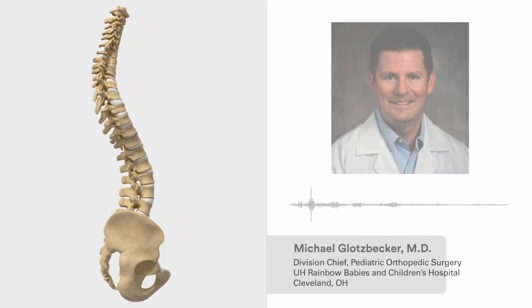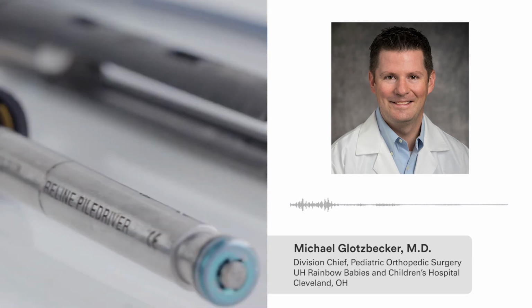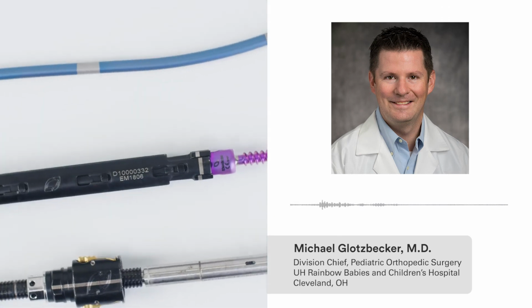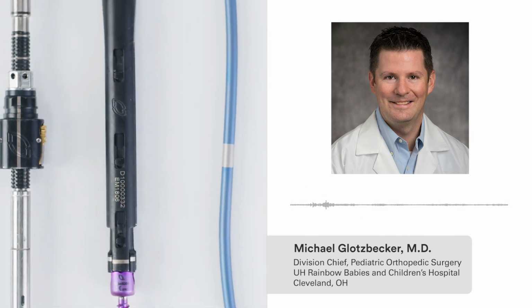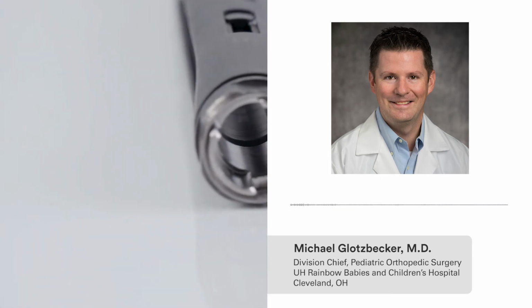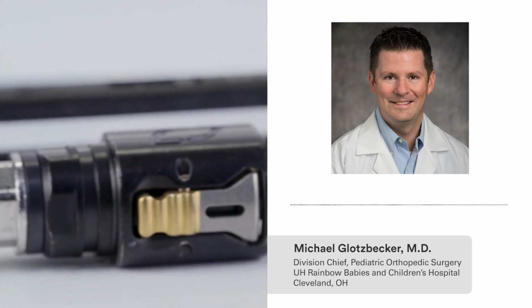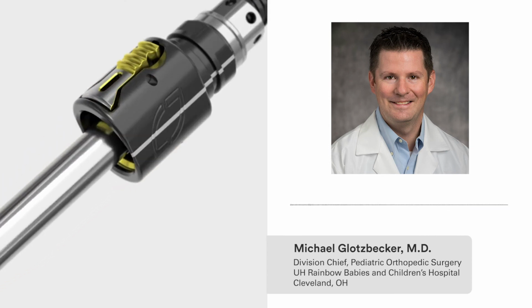If you think about spine surgery or the correction of scoliosis, there's a million steps. And if you've ever been in an OR during the rod derotation phase, there's a million tools being passed back and forth. When you're doing the correction, you're passing instruments back and forth. You're passing reducers back and forth. You're passing pile drivers back and forth. You're using the segmental racks, and trying to get it all hooked up. Every single one of those steps takes additional time. And so the more you can streamline that workflow and reduce the number of steps, we'll get that kid off the table faster.